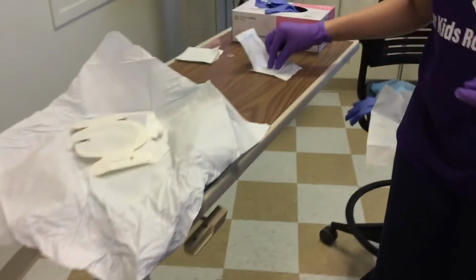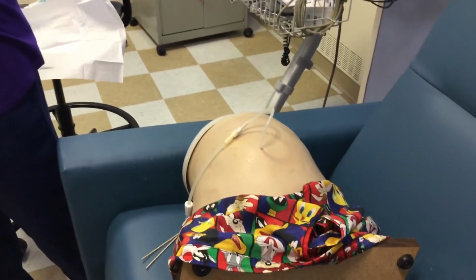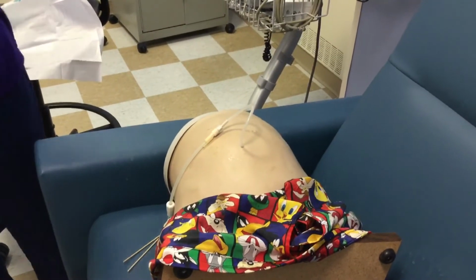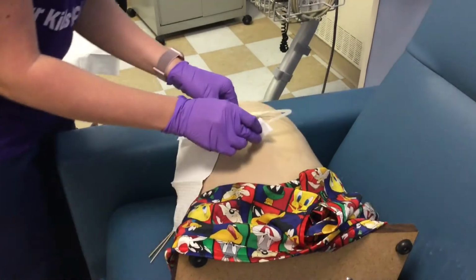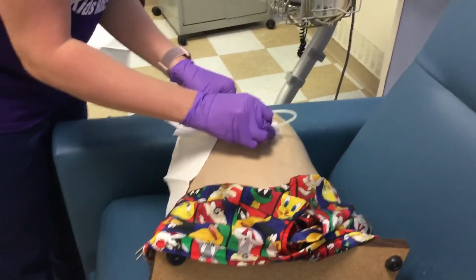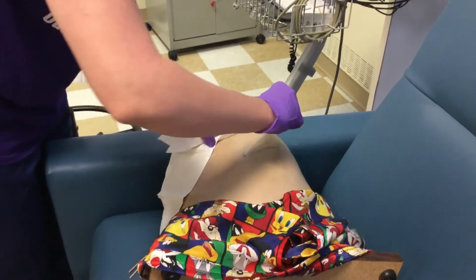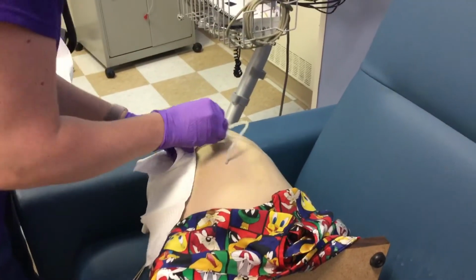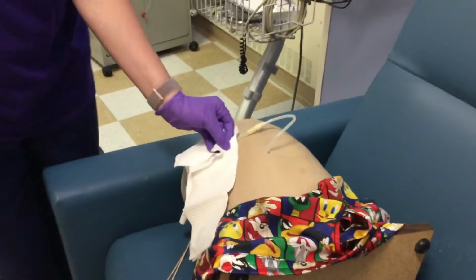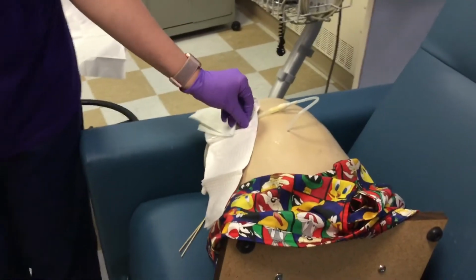Next, you will grab your gauze that is also pre-moistened, and you will cleanse the tubing, the catheter tubing. Same process, starting from the insertion site and working your way out, never going back towards the insertion site. You can use the sterile drape that is included in your sterile cap change kit to help hold the line so that way you remain sterile.